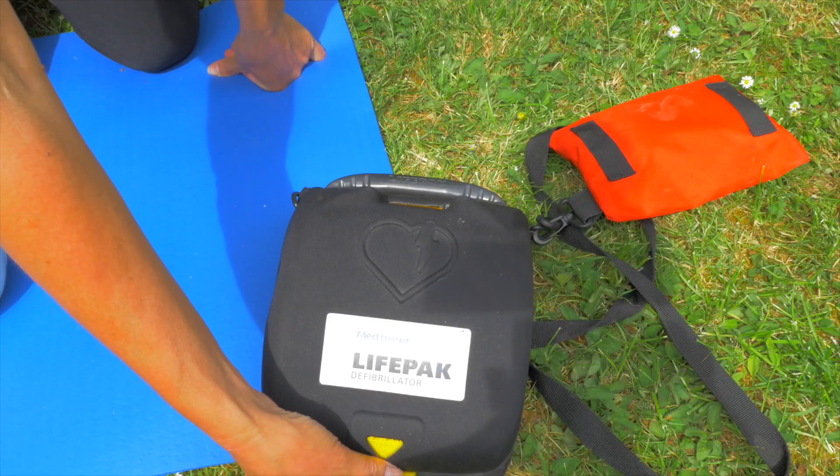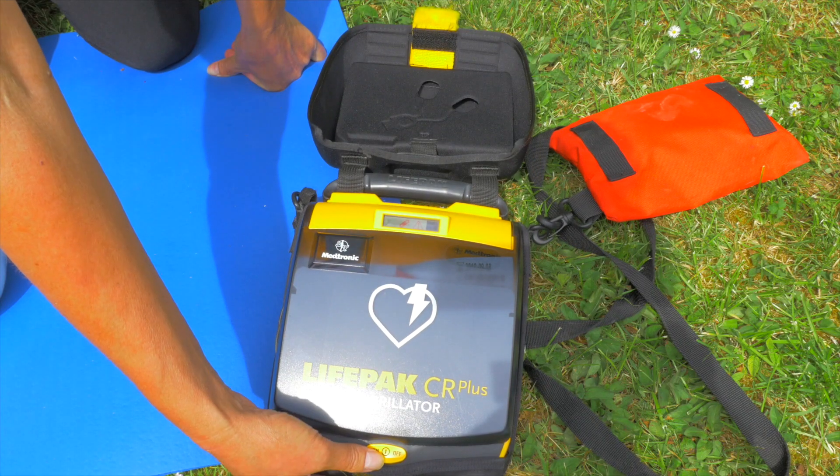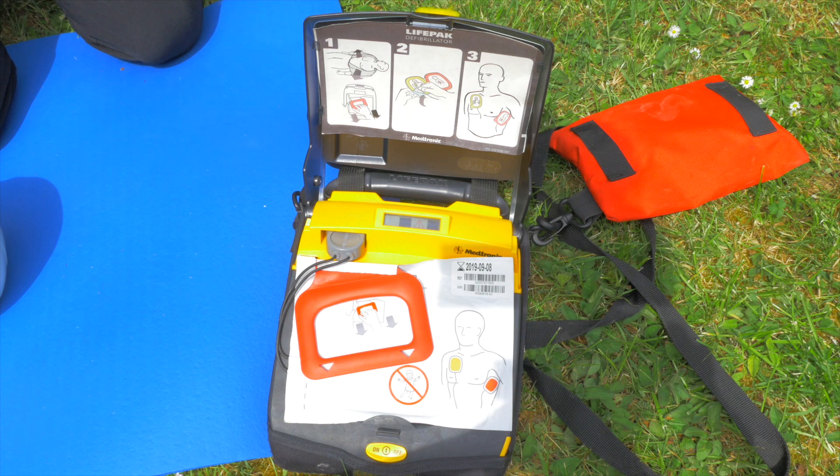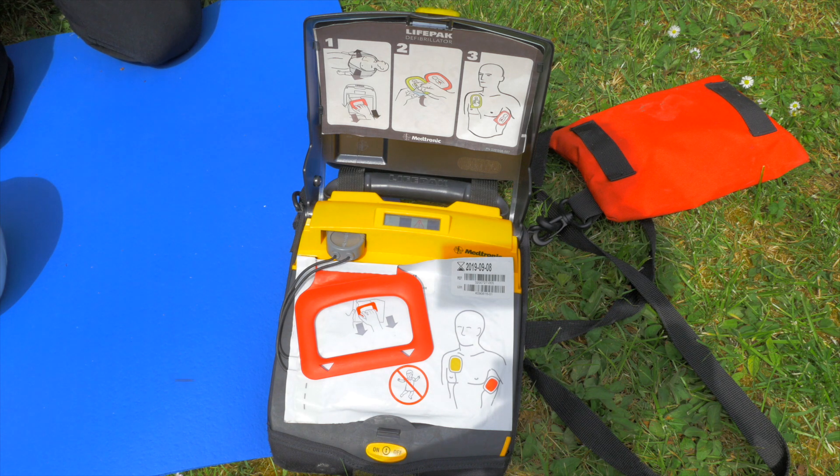When it does arrive, we literally just turn it on and then follow the instructions. It will say things like 'Call for help now' and 'Remove all clothing from patient's chest.' Sometimes that may have already been done, or it's just a reminder to have a bare chest.